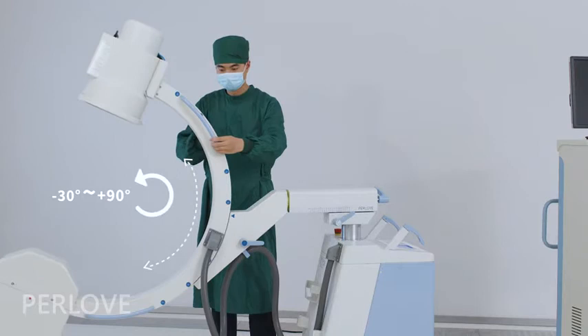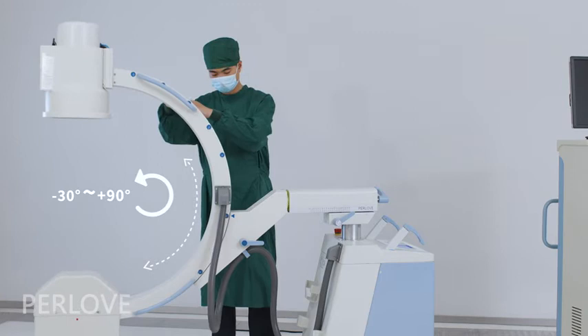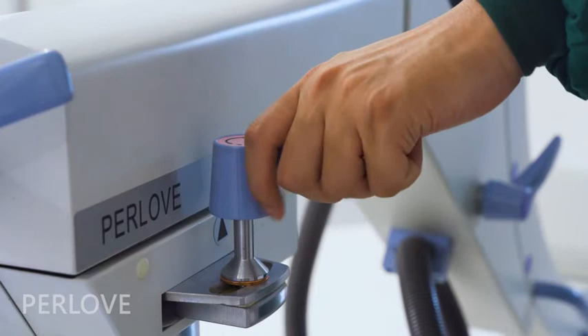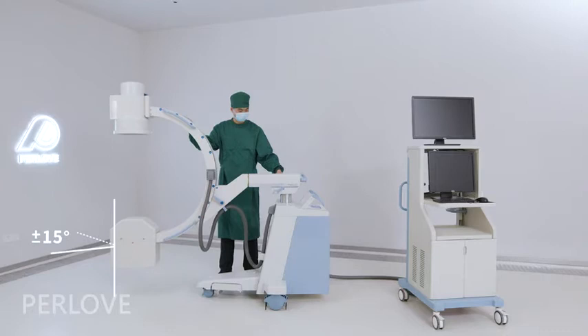When you grab the handlebar on both sides of the frame, the C-Arm can slide along the frame from minus 30 degrees to positive 90 degrees. Additionally, this handlebar controls the C-Arm rotation around the vertical axis from plus 15 degrees to minus 15 degrees.